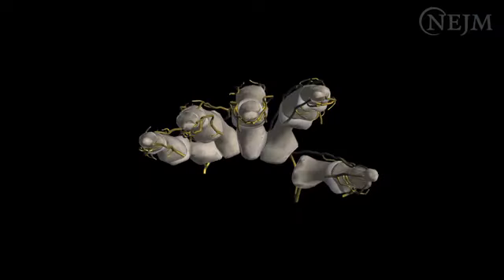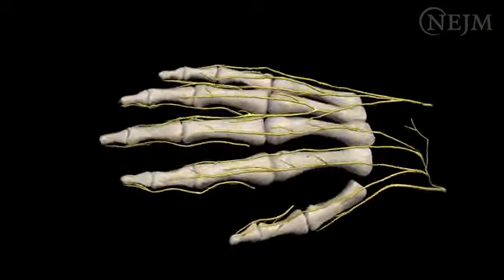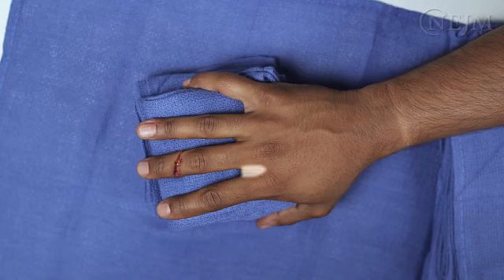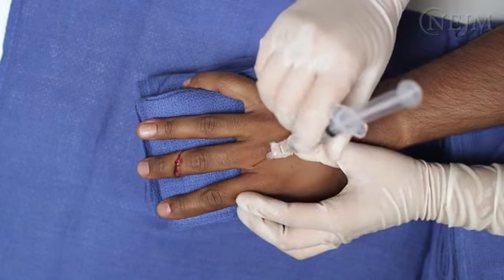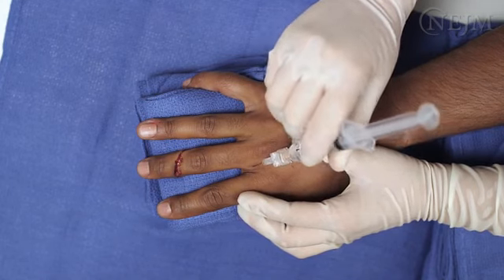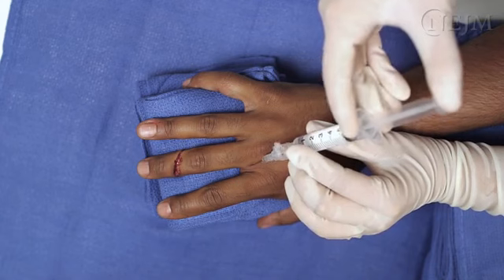Four nerves, running at the 2 o'clock, 4 o'clock, 8 o'clock, and 10 o'clock positions, provide innervation to each finger, including the thumb. Identify the web space on the dorsal aspect of the hand, where the finger joins the hand. Insert a 25 or 27 gauge safety needle at the web space and advance it until the needle reaches the palmar aspect of the hand.